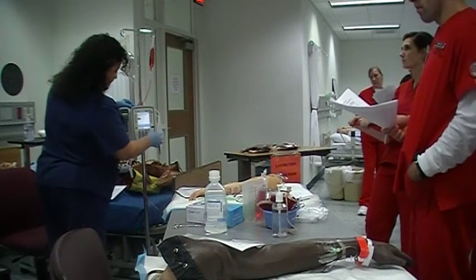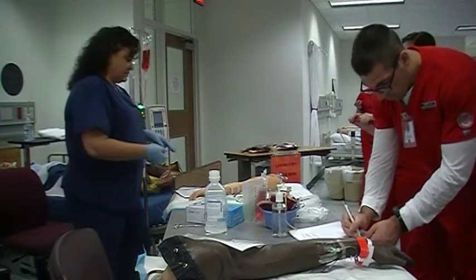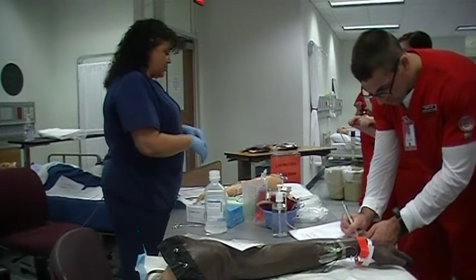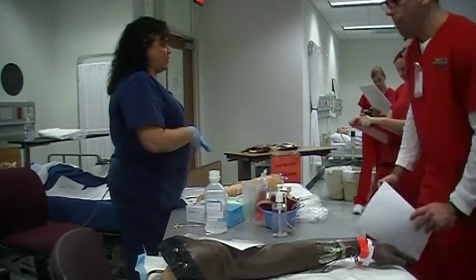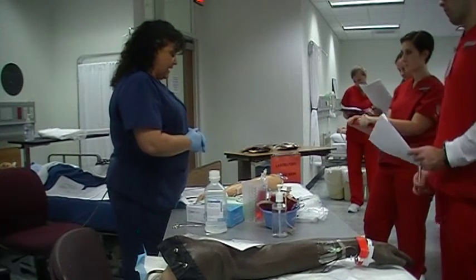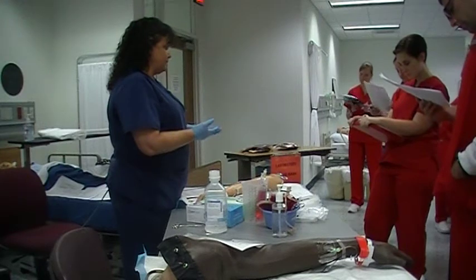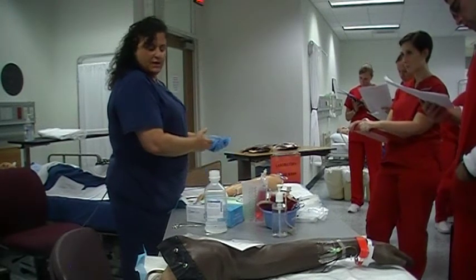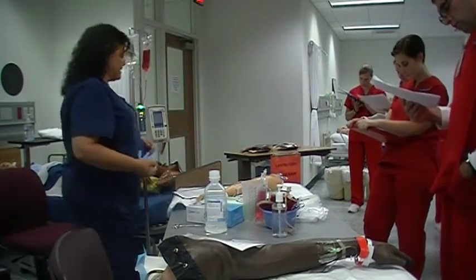Okay, and then we're going to hit start. We're going to tell the patient if you feel anything that doesn't feel right, any kind of itching or hot, headache, back pain, let me know. I'm going to stay with you for 15 minutes. And I'm going to recheck your blood pressure after 5 minutes, again at 15. And when's the next one, guys? 30. 30. And then after the transfusion's ended. Okay?